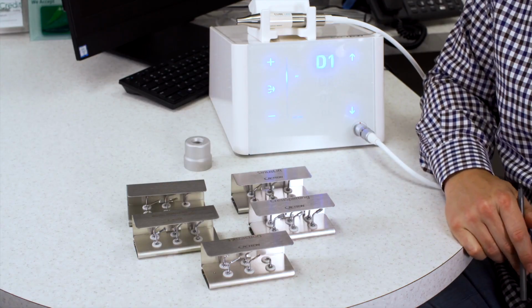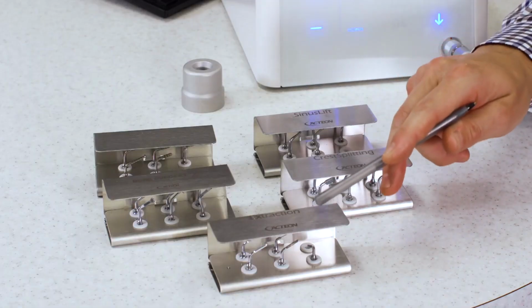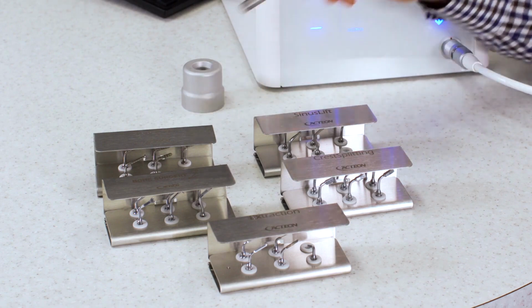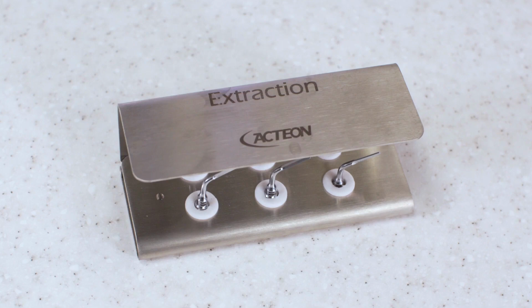Here we're going to talk about the surgical tips that the Piezotome Cube offers. They have an extraction kit, a bone surgery kit, a crest splitting kit, a sinus lift kit, and an intralift kit. They also have a crown extension kit and an essentials kit, which is basically just various combinations of these remixed. So we're going to run through the basic 5 here, as I think these are most applicable for implant surgery. First, we're going to dive into the extraction kit.